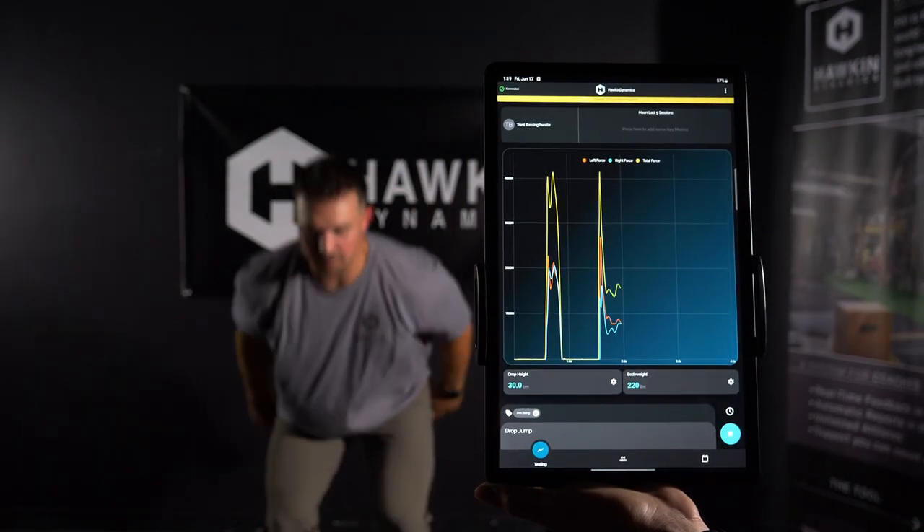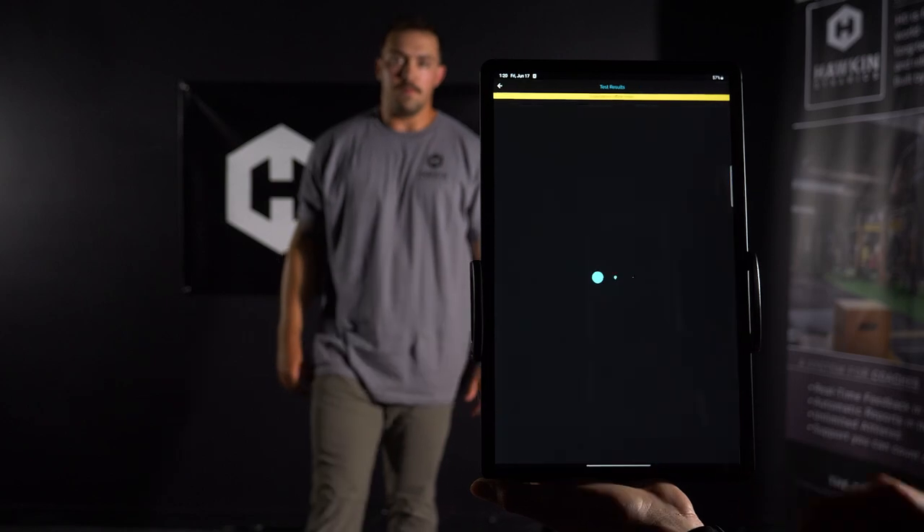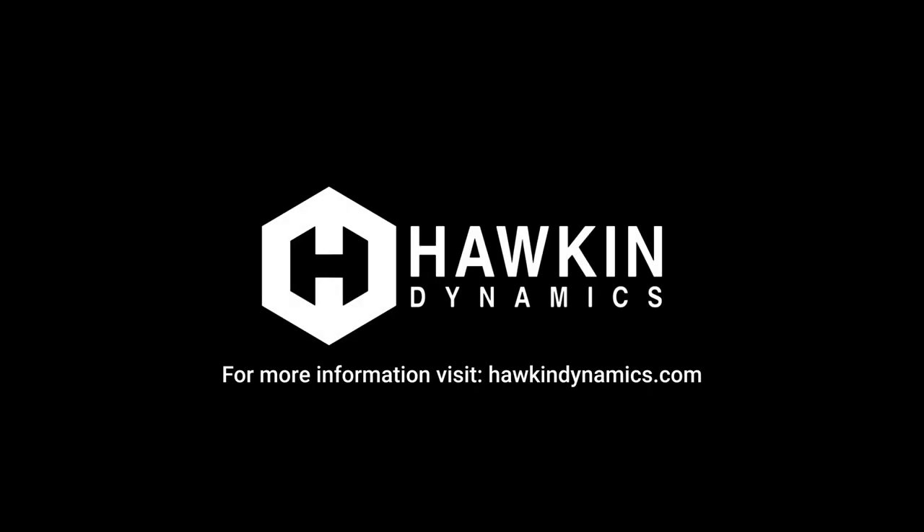After the test is complete, press stop or allow it to auto-collect. On the test results screen, analyze and save. Repeat the test for as many times as needed.